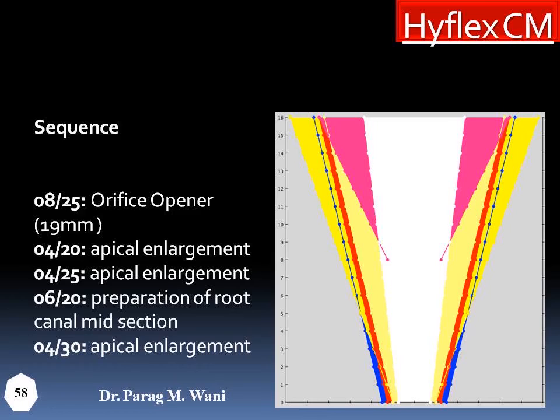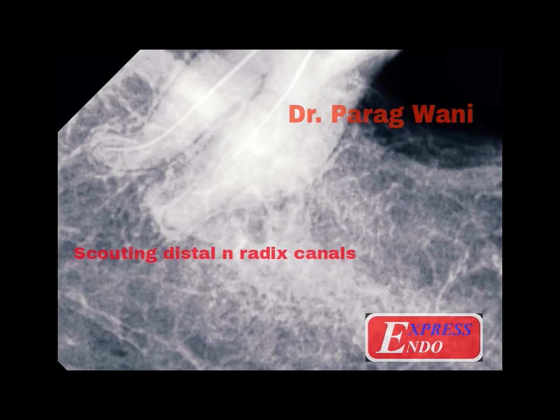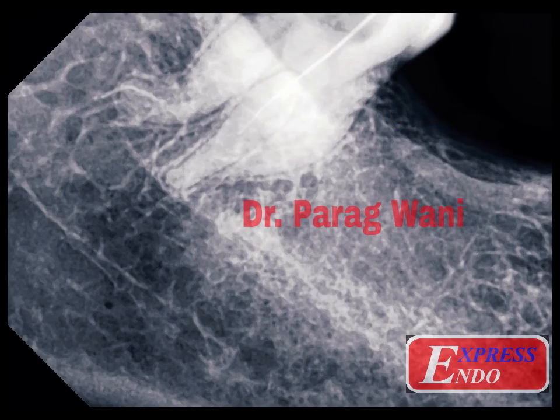Here you can see, according to the color difference, we have prepared different areas inside the canal with different files. So none of the files has too much load on it. Now sharing some of the cases done by this file and this technique.